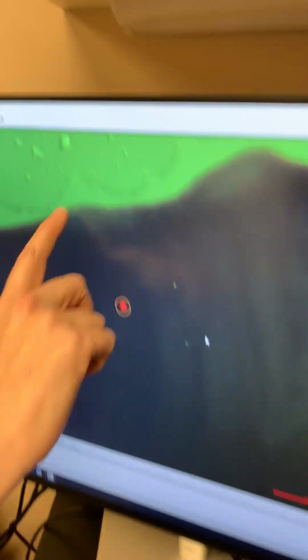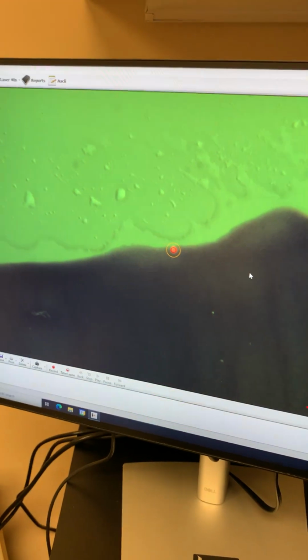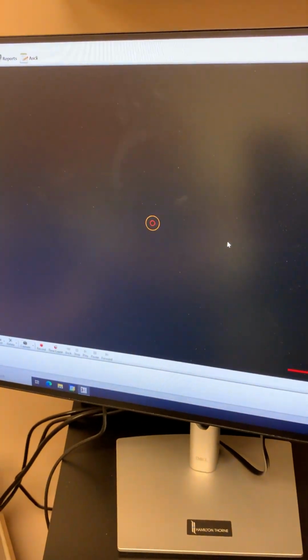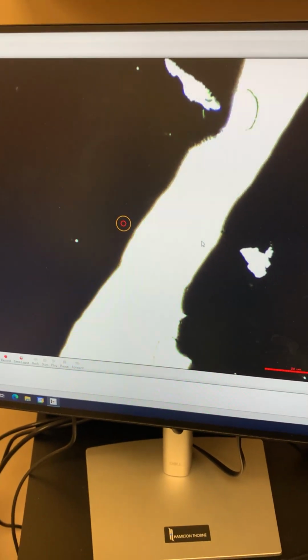So what we would do is see that. Can you see it in the screen, that red dot? So that red dot is where the laser would shoot, and then the circle around it is where the blast radius is of the laser. And you can actually see that happen. Yeah. Wow. I can see it. I could see it. Either I can look on the screen or I can look there. So basically, what I would do is, pretending this was an edge of an embryo, I would go up along the zona, which is the shell of an embryo, and I would blast right along it. Let's see if it behaves.